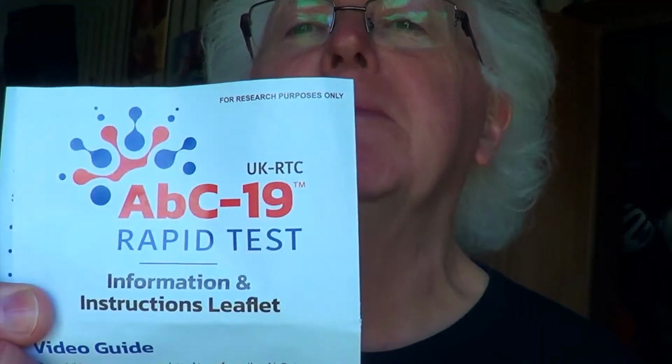I'm about to test my blood using this kit. If you've been infected with COVID-19 or if you've had the vaccination, ideally the test kit should be able to show that you've got the antibodies built up in your blood. If you are vaccinated or you're in contact with the virus, if you're actually infected with the virus, then your body will have made antibodies against the antigens of the virus.